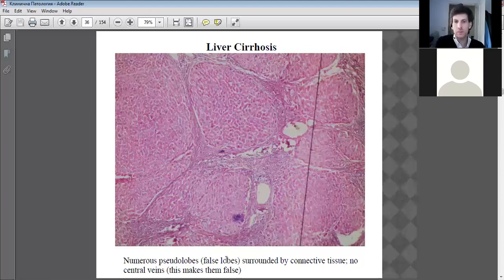Here we got some example of false lobules, lobular structures that are beginning to form. So there's lots of these little round ones where normally you'd have a big lobule. There's lots of smaller ones being formed. This one on the left is a big lobule, but these ones have got lots of little lobules, which is a bit abnormal, if you like.